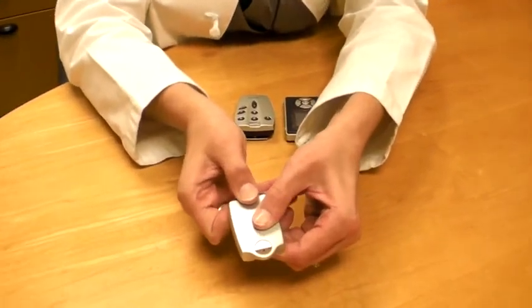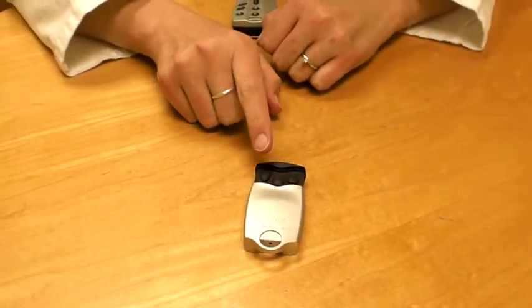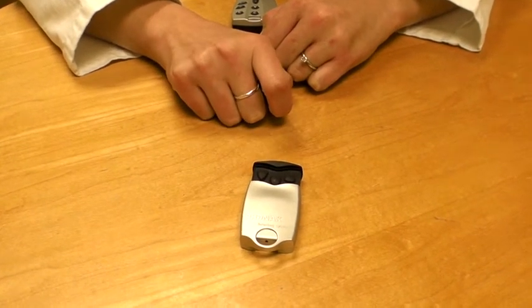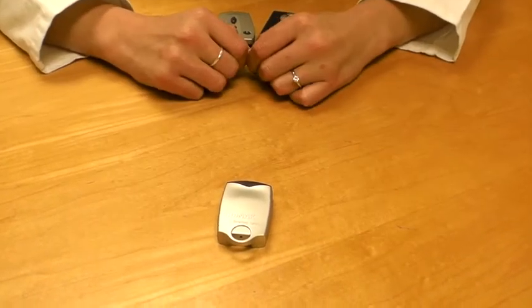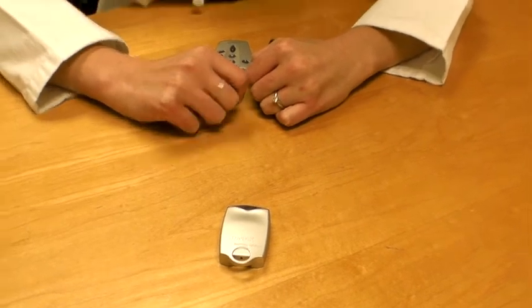Remote controls can be quite basic that look like this. This has the option to turn the volume down or up and changing the program. It can also be reduced to be quite small and fit on your keychain so you never lose it.